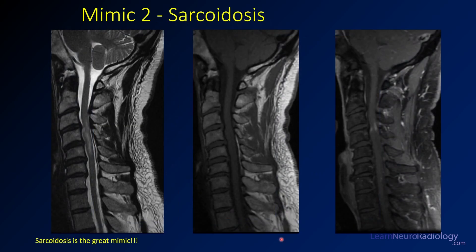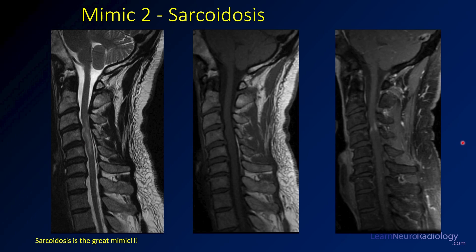Our second mimic is sarcoidosis. At our institution we see a lot of sarcoidosis — it's definitely something to think about. In the modern era, sarcoidosis is a great mimic. We see T2 abnormality in the center of the cord. On post-contrast imaging, the enhancement is particularly along the surface of the cord. There's not a discretely formed mass, although the cord is a little expanded. Keep in mind it might be an inflammatory disease like sarcoidosis.